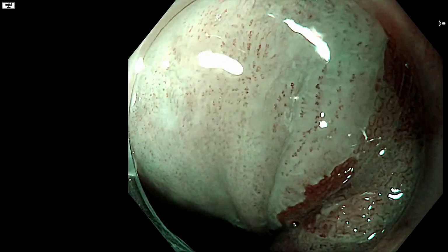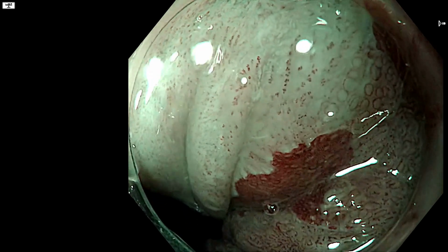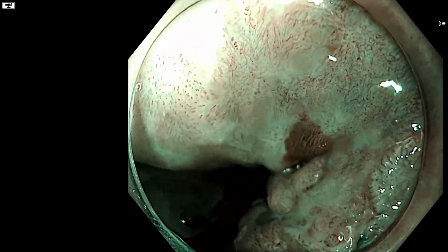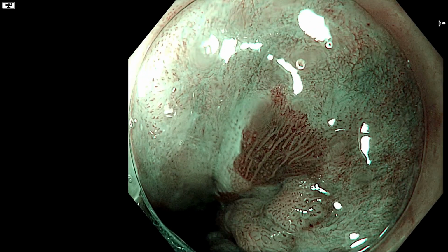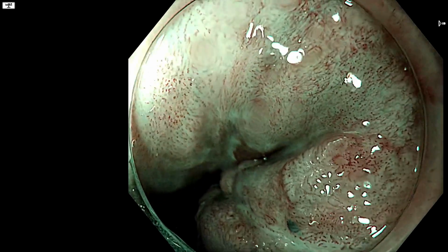You have actually got, for comparison, just here in the center of the image now, some normal intrapapillary capillary loops. And then if you compare them to the ones that you see down here, on the right hand side, you have some bridging different palisades, and you have some which look inflamed and some which are a bit irregular. So that's clear. But then as we come up here, you need to be careful, because that's a piece of Barrett's mucosa, I think, in the center. So if we freeze the image, you've got in the center a piece of Barrett's mucosa, underneath a squamous dysplastic area, and then here, certainly this is also not normal.